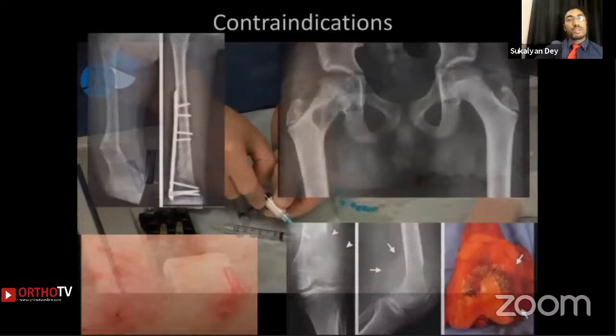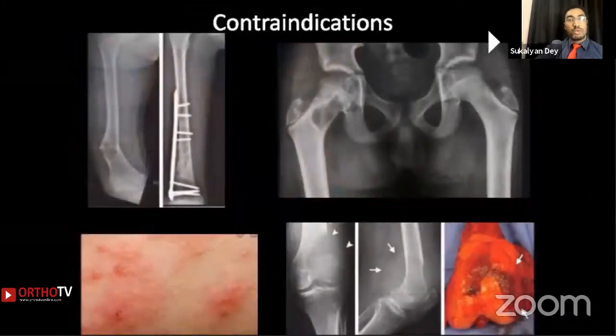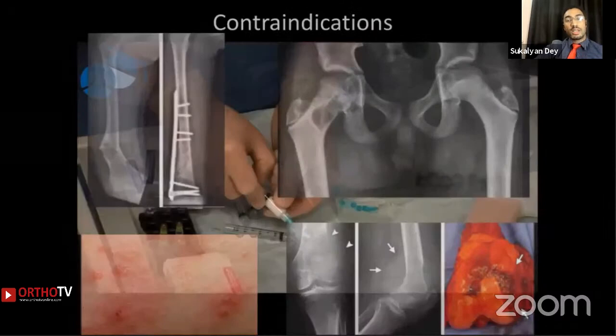So sclerotherapy is not for every lesion. It should not be performed in pathological fractures, in lesions which are on the verge of having a fracture or are mechanically unstable, or if there is any known hypersensitivity. If a biopsy has been performed, the sealing off of the biopsy site should be allowed, and it takes about 3 months. And it also should not be performed if the aneurysmal bone cyst is secondary, such as in this case secondary to the giant cell tumor.